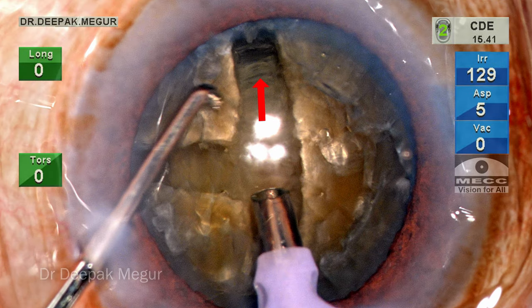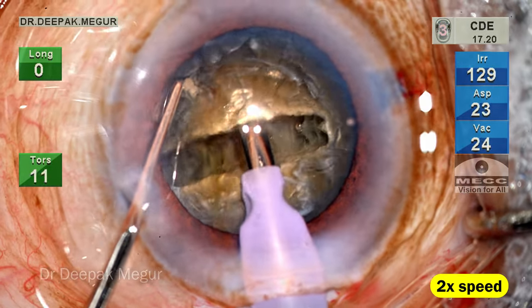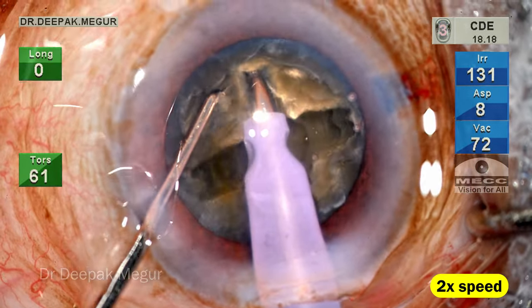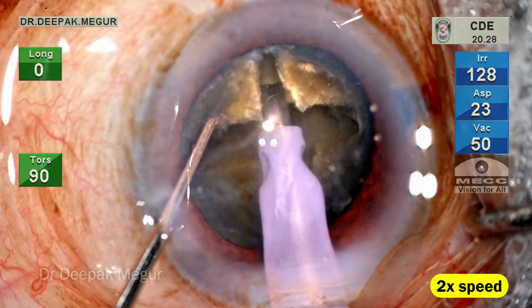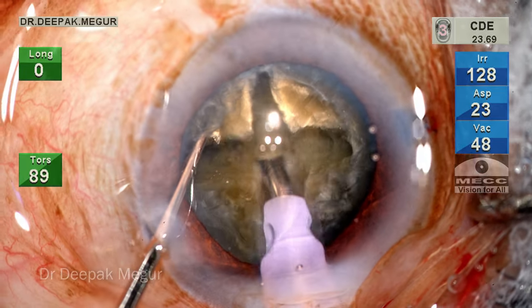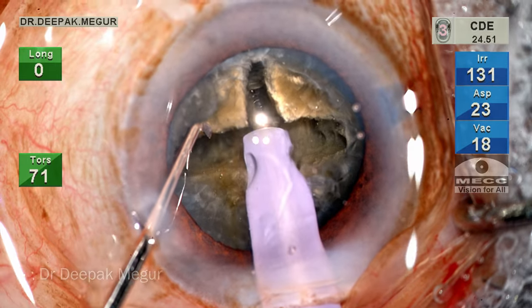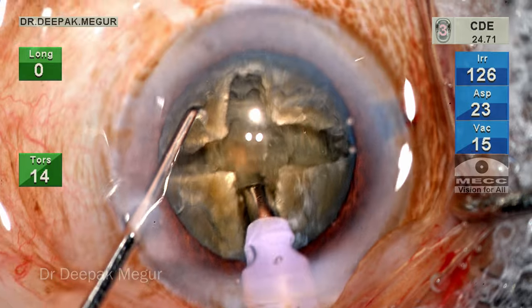At this point, I can still see the horizontal striations across. Now I'm going to do the last groove — that is the fourth groove in the plus sign. This is going to be the deepest groove on the first attempt itself because the other grooves have already been made. At this point, we can notice that the central part is still thick enough, so the trenching is continued in the other part.